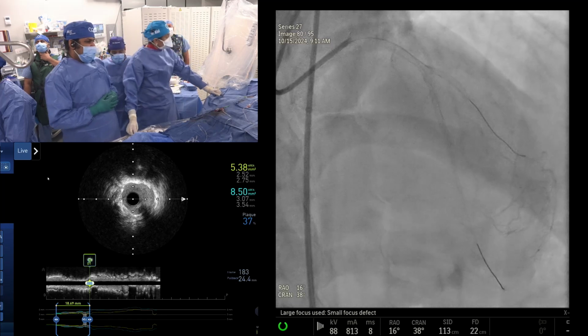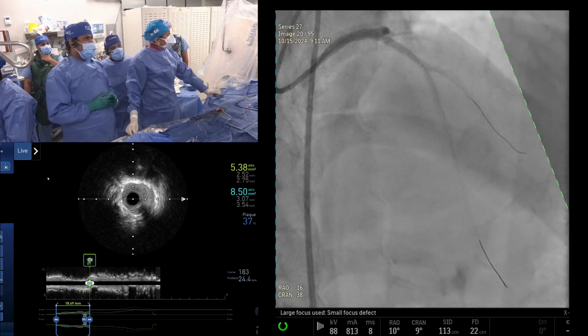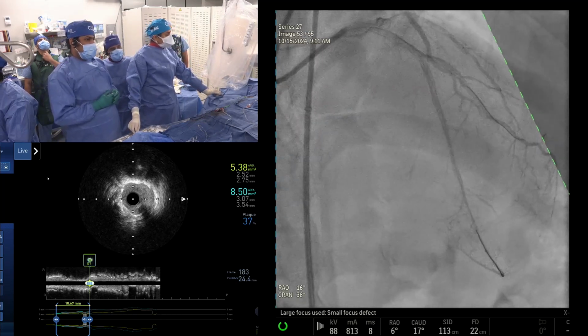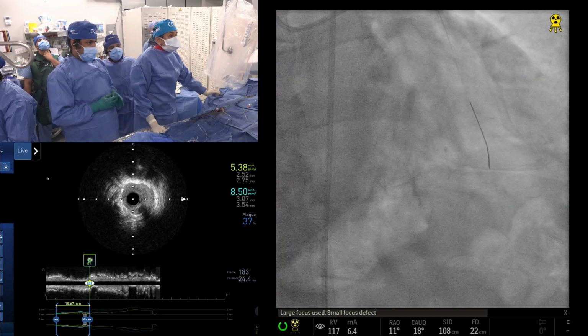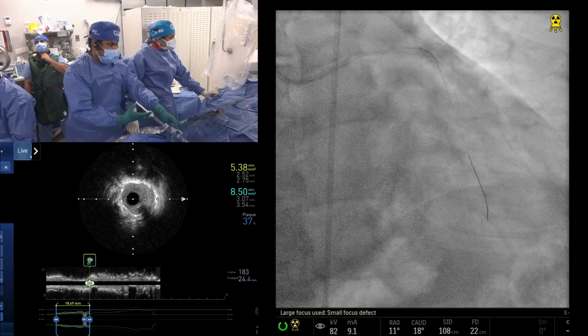Probably not. To me, we would leave this alone, because the young guy, I mean, I'm just saying he's a once young guy. Yeah, that used to be different. Leave it alone. Yeah. So he needs to be brought back. Let's take a good picture. Magnify, magnify.